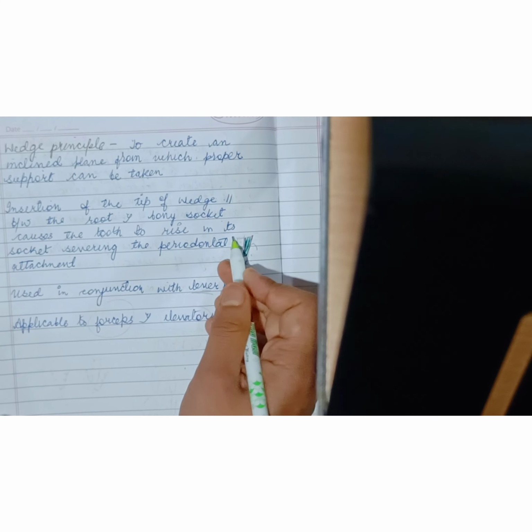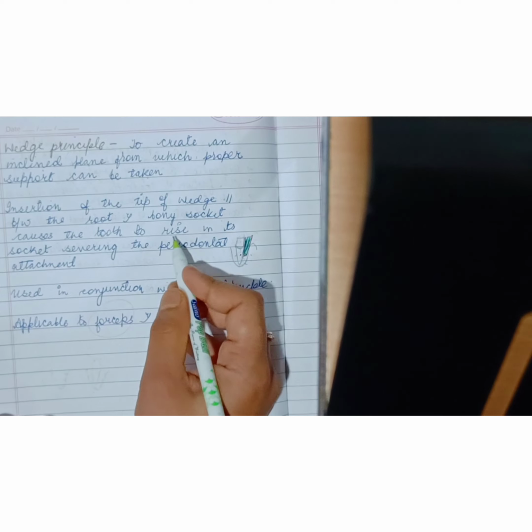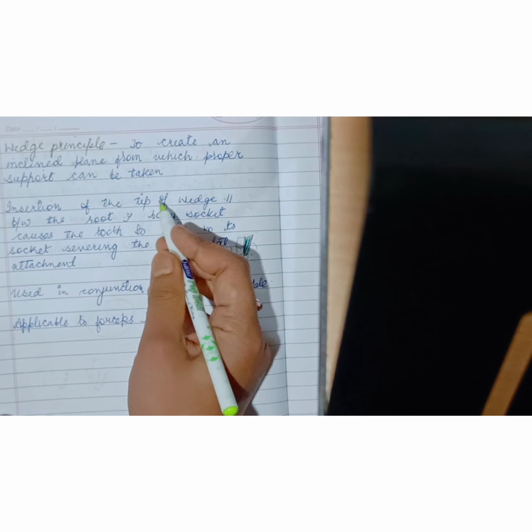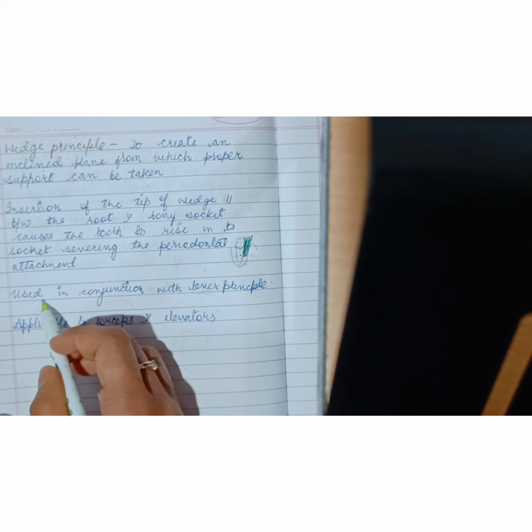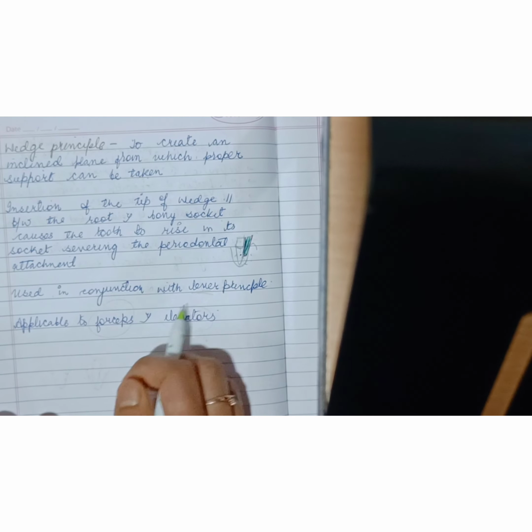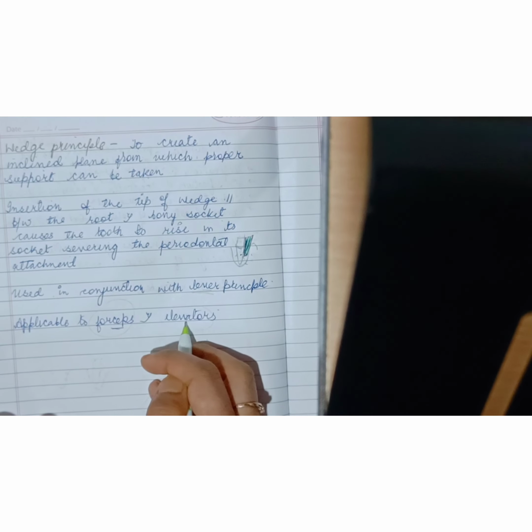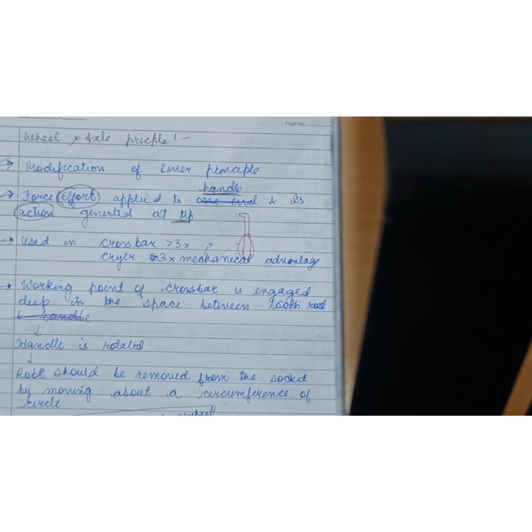So when it rises in the socket, the periodontal attachment is severed. So the tooth will eventually rise in the socket. This is the wedge principle. So this principle is used in conjunction with the lever principle, and the inclined plane can be created with the help of forceps as well as elevators.